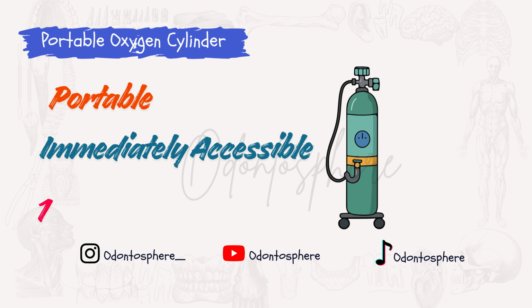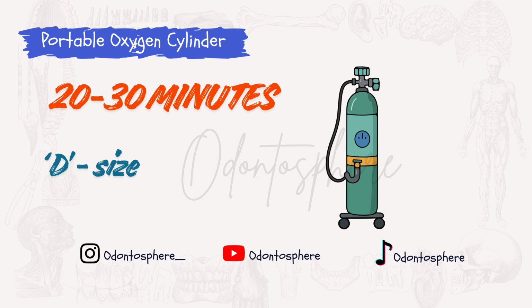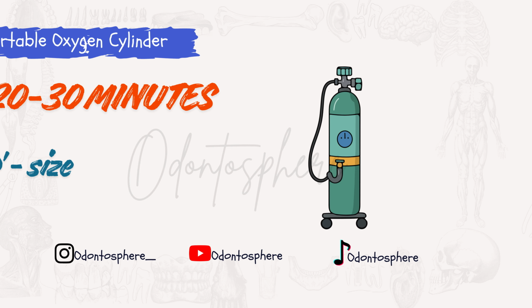It should deliver 15 liters per minute of oxygen for sufficient duration. So you're looking at around 20 to 30 minutes. So the ideal size for this would be a full D size cylinder.